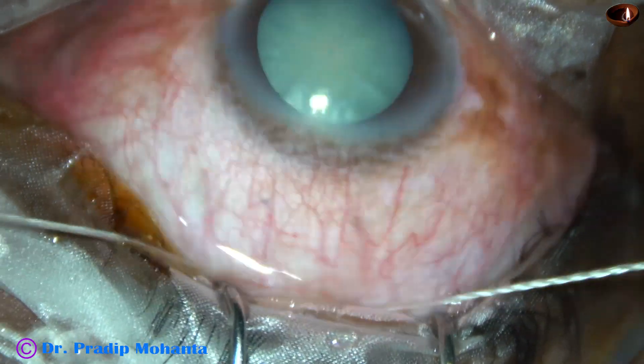In this case, the mistake I have done is I have placed a very large incision, about 8 mm. The surgery could have been done with a 6 mm wound, but the wound has been placed about 8 mm. This is the main incision — a mild frown incision. It could have been a more frown, a little smaller wound.